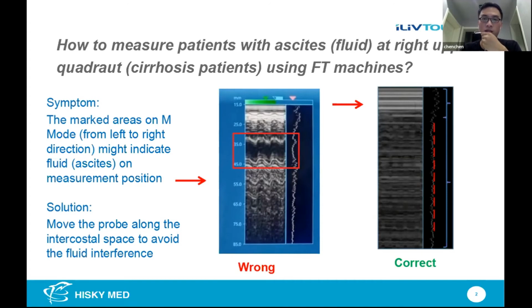If you can see a good image of M mode, you can try. But we don't suggest it. Usually we just suggest the patient to lie down. But for some special cases, sometimes we try the sideways. But in sideways, you still have to make sure the M mode and A mode pictures satisfy our requirements, with no interferences in it.